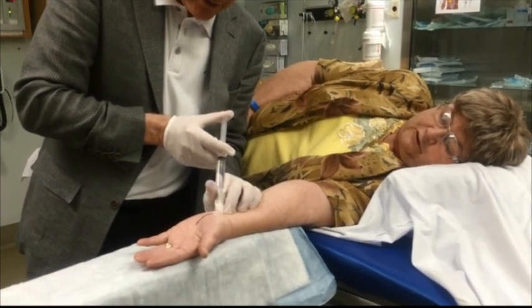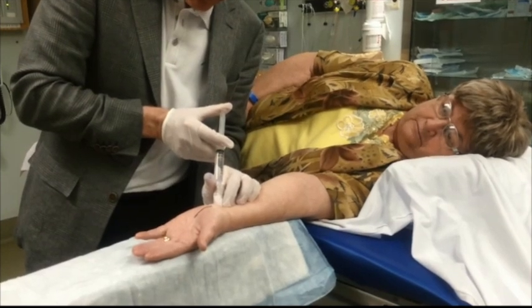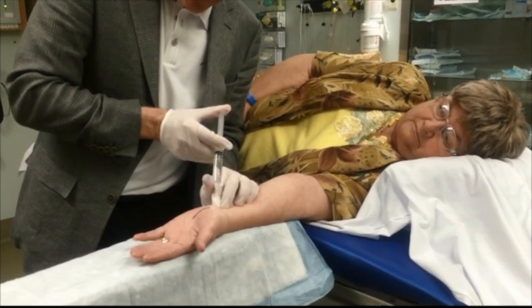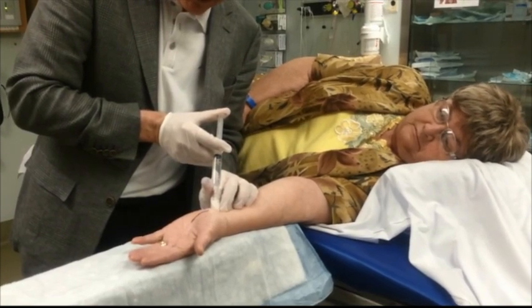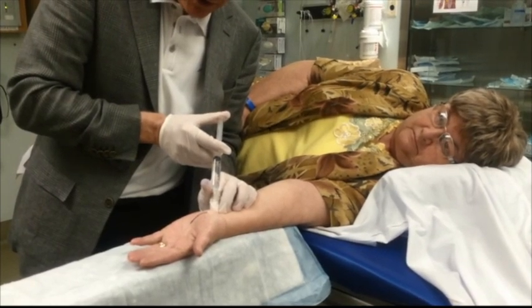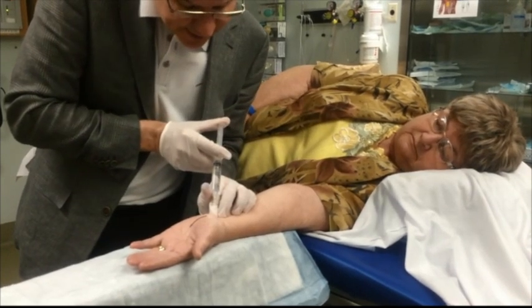Muriel, is the sting of the needle all gone now? It's gone completely. How long did it take to go away? A second. Sometimes it takes five or ten seconds. At this point, the sin is to blast it in quick and move your needle around. You want to keep your needle in one place and get at least two cc's in there.